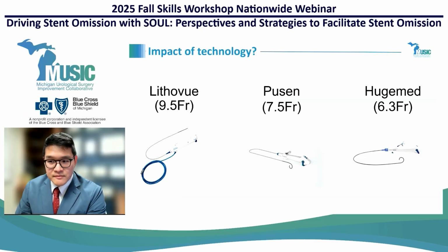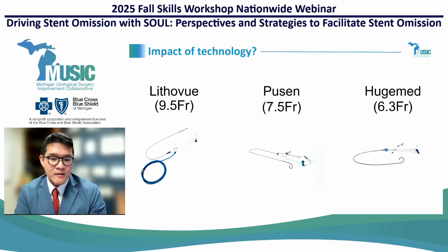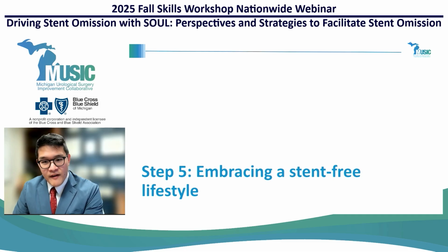And then technology, as scopes continue to get smaller, are we going to feel more comfortable with not putting up a stent afterwards because the ureter is easier to navigate, because you feel like you're doing less trauma? I think that is also hugely beneficial. And step 5 is really just embracing the stent-free lifestyle.